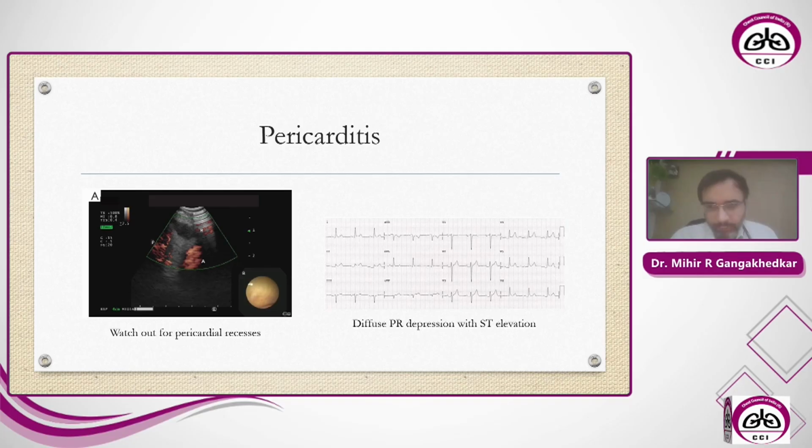One doesn't think too frequently that pericarditis is something that could occur with a patient who's undergone an EBUS, but this was something that was published, and this is something that one really needs to look into, that pericardial recesses could sometimes mimic lymph nodes even on your ultrasound. And one of my juniors from MBBS days, who's now working in the USA, published this report. And in this report, the patient did develop pericarditis.